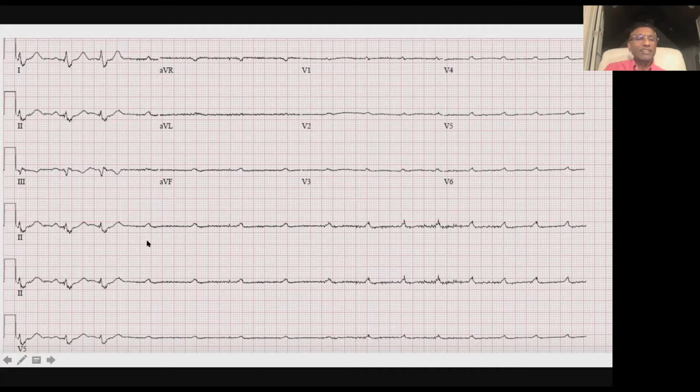Okay. So a patient comes in with COVID, fevers, on overnight telemetry, and then this was actually captured on a 12 lead, if I'm not mistaken. Yeah, this is a full 12 lead. Yeah, I think we've got all the leads. And they kept doing this. And so that was the first tracing.